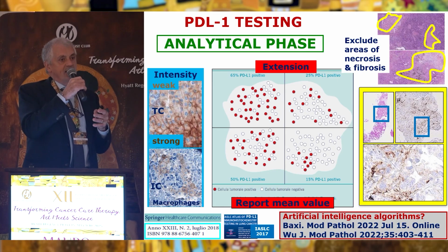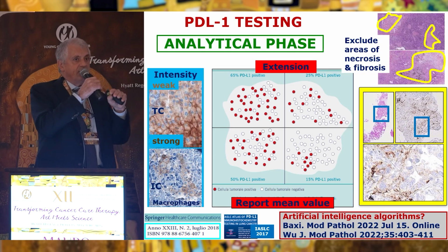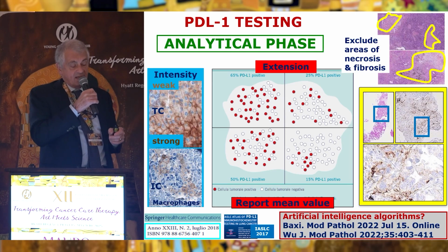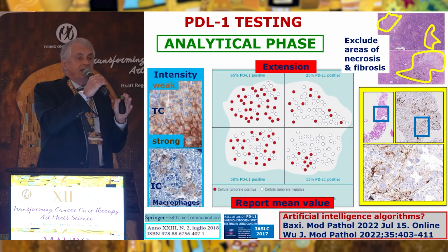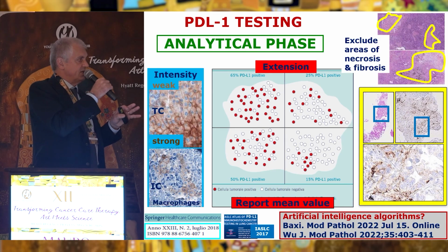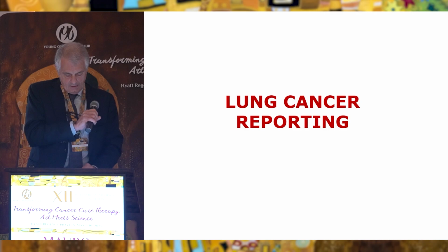And in other areas like breast, there are different conditions, different antibody, different target cells to be measured, like lymphocytes and macrophages in addition to tumor cells. And therefore, the regulation for interpreting PD-L1 expression is different in each individual tumor area, which for a general pathologist, as we are, is sometimes complicated and difficult.